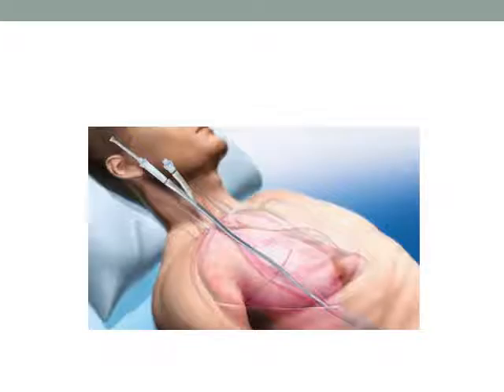Everybody here has probably seen a central line placed, and you know that as you're putting the line in, if you put the wire in too far, it often goes into the heart and you start getting some ectopy. The wires want to go that direction. Well, for putting a patient on ECMO with an Avalon, you don't want to go that direction. You want the wire to go straight down and into the IVC. You don't want the wire to go around to the heart. That actually is the hardest part of this whole procedure, under fluoroscopy manipulating those wires so instead of going into the heart, they go down the IVC.